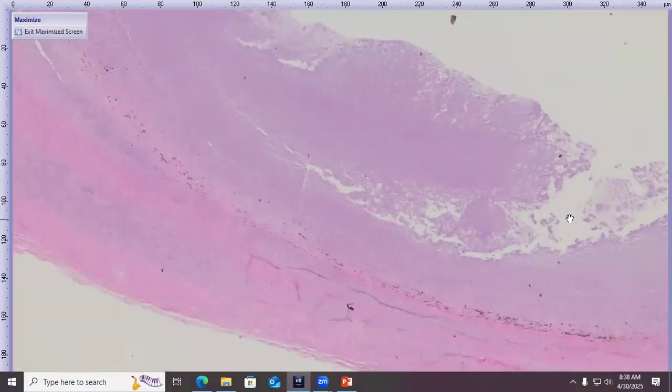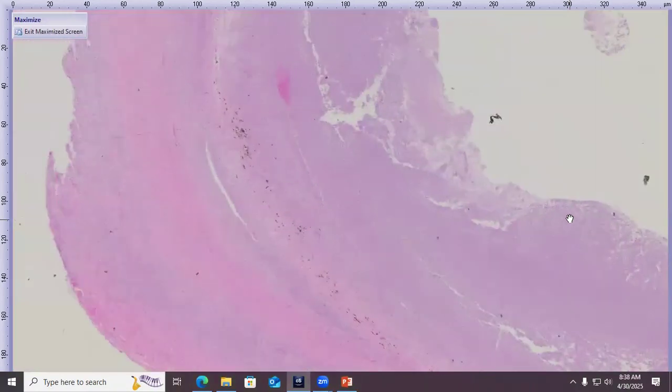Because of the suprachoroidal location, you might argue that there's a potential for systemic spreading into the eye. It's possible. The chorocapillaries would be a little up high, but it looks so well delineated, and it really looks like a penetrating lesion. Basically, long story short, there's a variety of ways bacteria can get to the eye. It's worth considering some, but definitely a lot of things point to penetrating trauma.